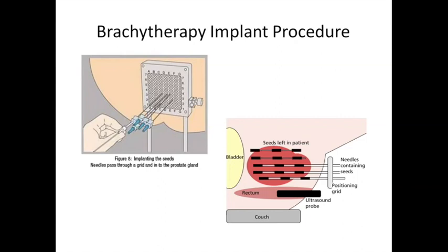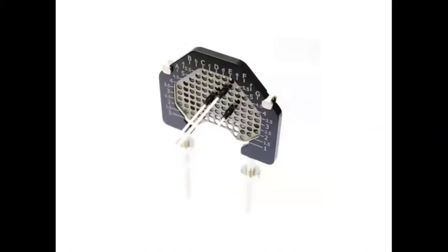And we work together with the radiographers and the physicists in the theatre, and we put the needles into the prostate. This is a picture actually talking about the implant of seeds in this particular case, and this bottom right image is showing you some little black blobs, which are the radioactive seeds, which are connected by a little thread. That's not the procedure for the high dose rate brachytherapy, where what we're putting in are blind ending plastic tubes. And then they stay in that template, this template that you saw here, and they're locked into place by a clever locking device.